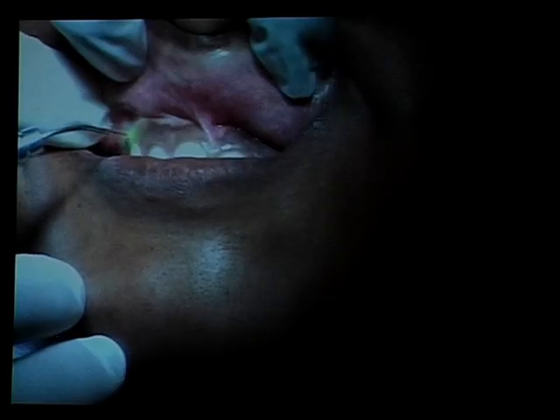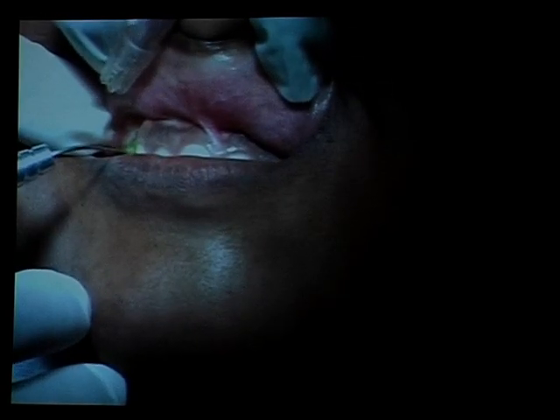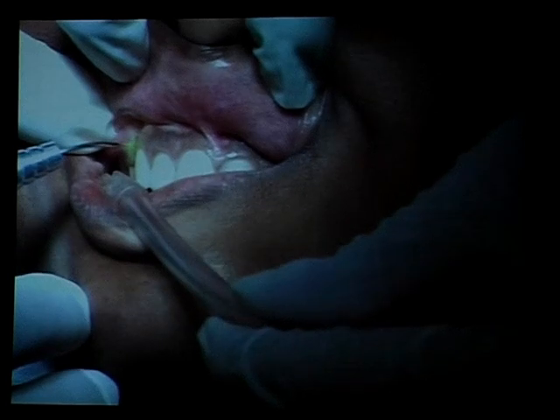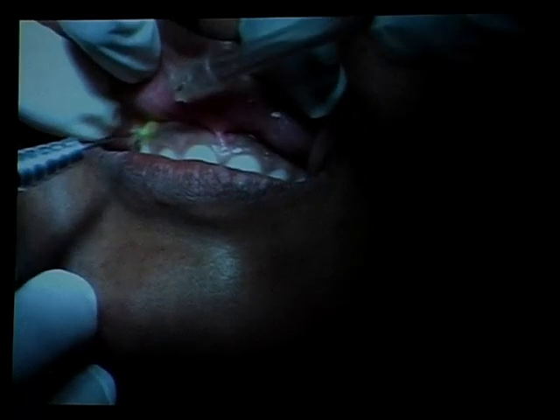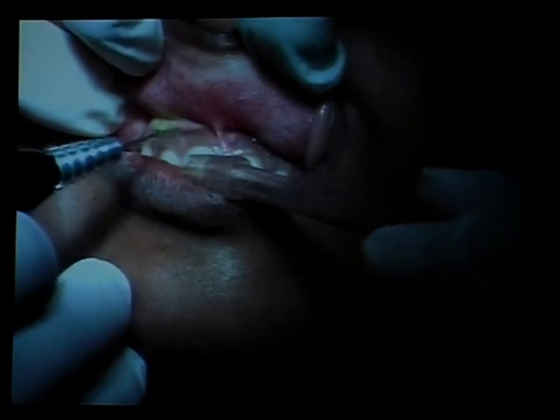There are 2 ways of doing this, and you can see there's a plume happening there. Can you see it? That's the thermal effect of the laser. There are 2 ways of doing this procedure. One is to directly go in at a 90-degree angle, and the other is to use light brush strokes. I prefer to use the light brush strokes, but that is a personal choice.